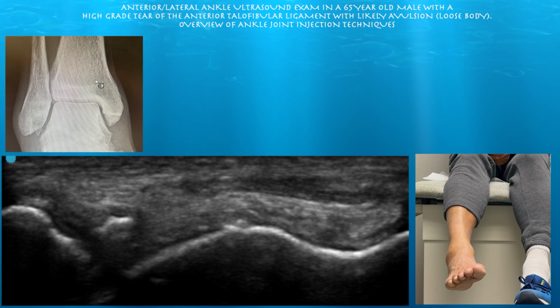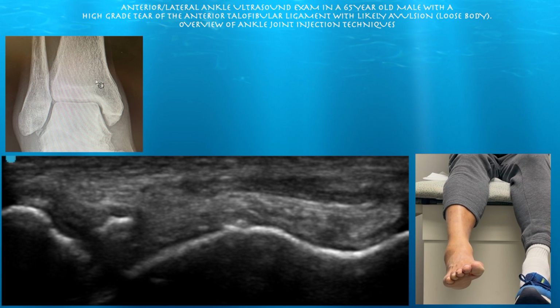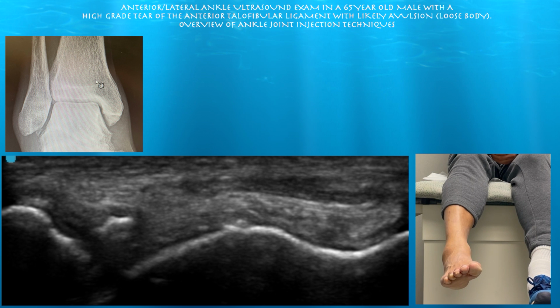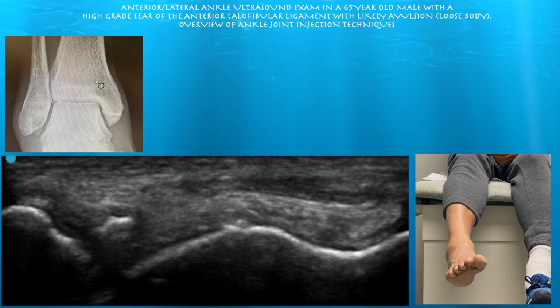Okay, 65-year-old male here for swelling in the right ankle. No significant discomfort, although he does note a little bit of pain in the retrocalcaneal bursal region with active plantar flexion. We're going to go ahead and just do a quick ultrasound.